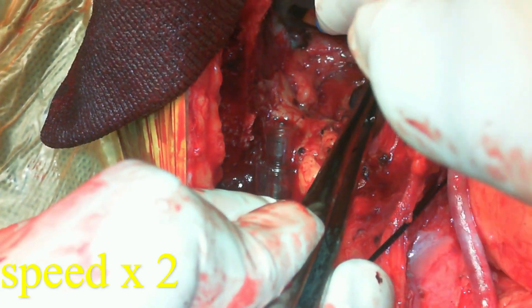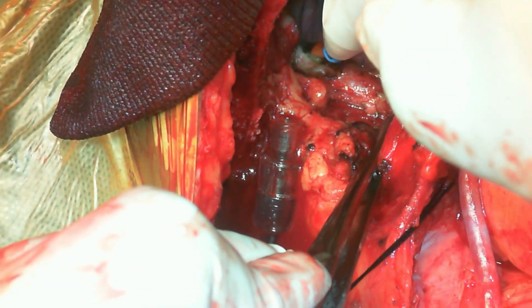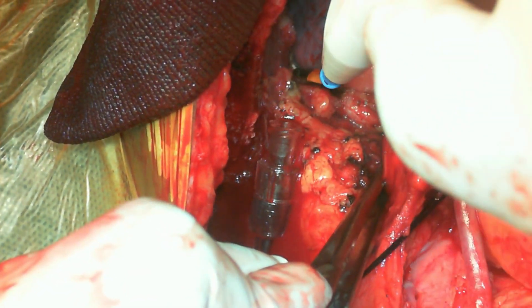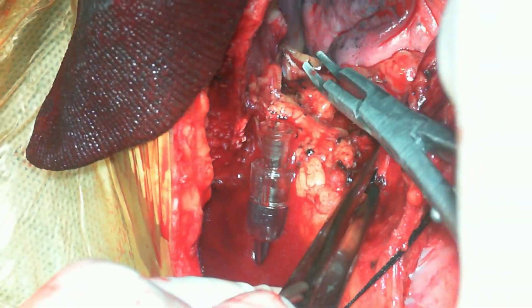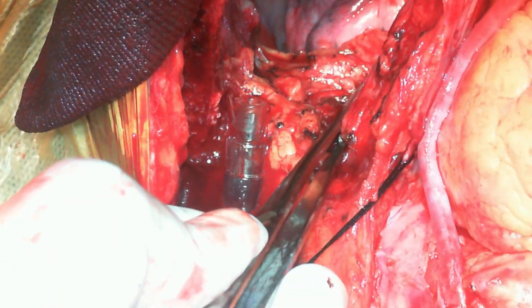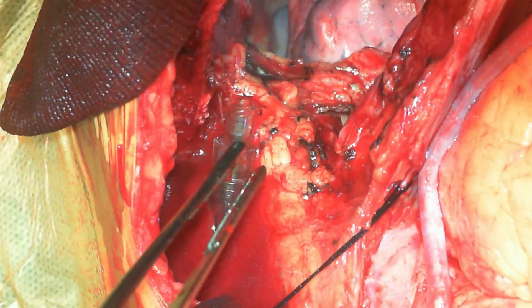The patient is under anesthesia, and once extubated, the LIMA has to sit free when the patient is coughing or taking a deep breath. There should be a free length of LIMA between the medial aspect of the left upper lobe and the pericardial surface.